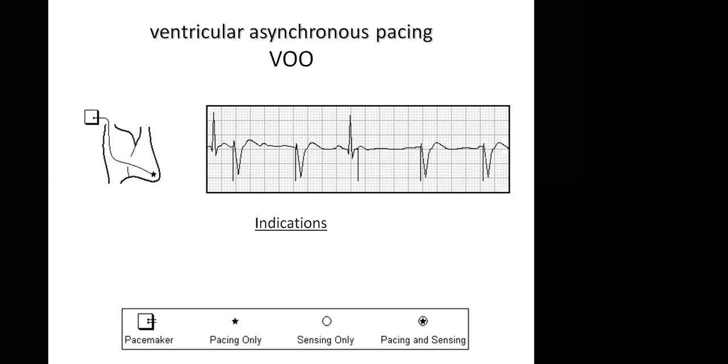So if that is used while the patient is on a pacemaker, it will be sensing that electrical activity is happening, and the pacemaker goes silent. You know that the patient has gone into a flat line. You'll be seeing the ECG tracing, but you'll be worried that the patient's blood pressure is going down and SpO2 is going down. What's happening? John, did you cut something? You know that it's the pacemaker that is already silent.